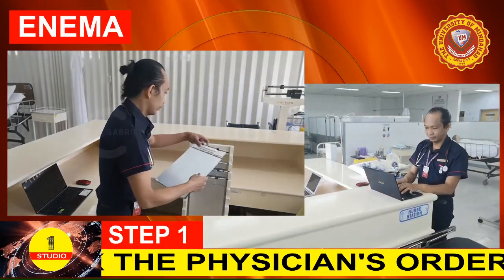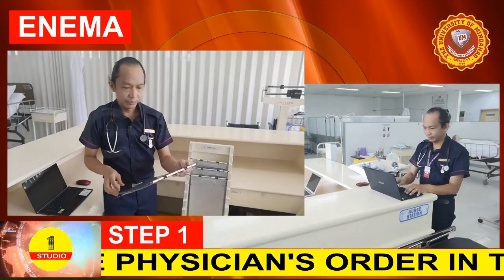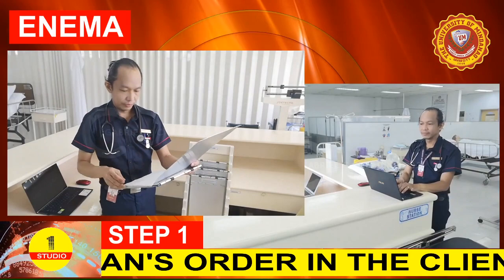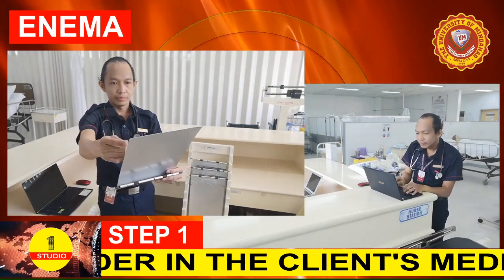Step 1. Check the physician's order in the client's medical chart or electronic health record.